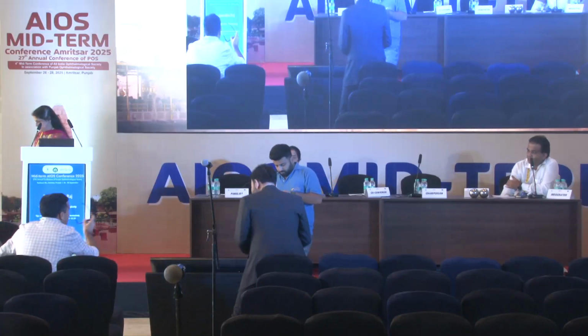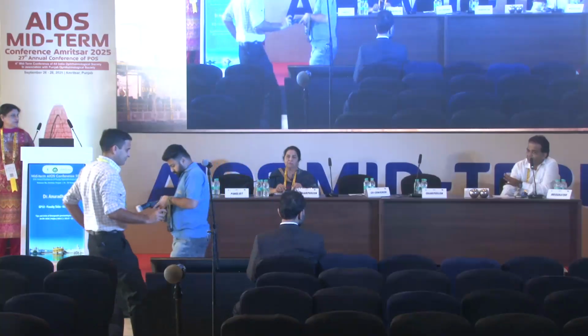I think the best anesthesia for TPK is general anesthesia. Yes, all TPK cases should be done under GA, if available. Because your heart is also pounding very high, and the patient's too. And we feel bad when only the tissue is disturbed, rest everything is normal and comes out. It could have been saved. And even under GA, you should tell the anesthetist to deepen the anesthesia. Yes, I always tell. Sometimes they give very mild GA and you are doing the trephination.